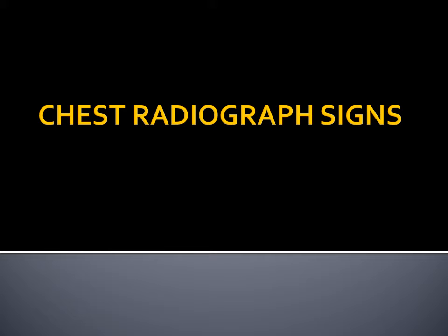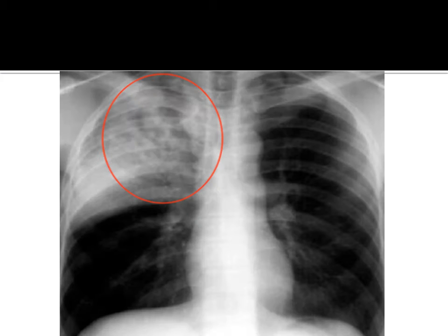Hello, today we are going to discuss a few chest radiograph signs.